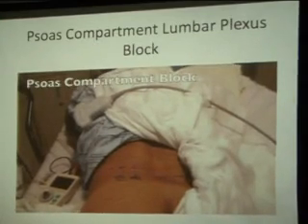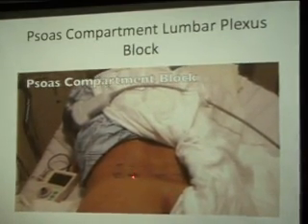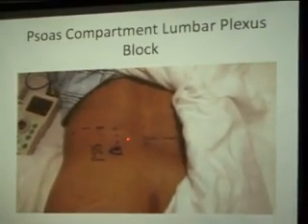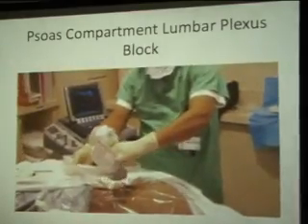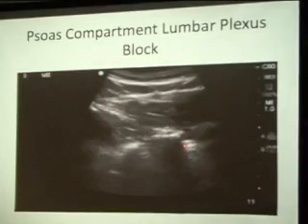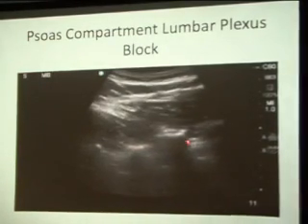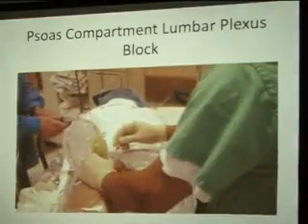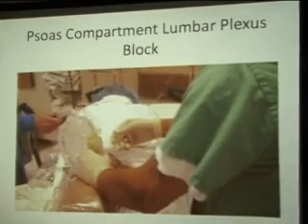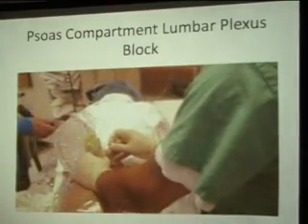So here's a patient. We do it in a prone position. The PSIS is the line which intersects with the intercristal line, and that's approximately the area where we start our scanning and look for the transverse process, where you can see the hyperechoic areas and the shadows below that. It's a fairly deep block, so we generously infiltrate the whole area with a lot of local anesthetic solution.